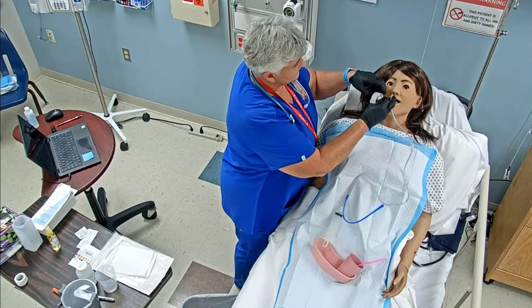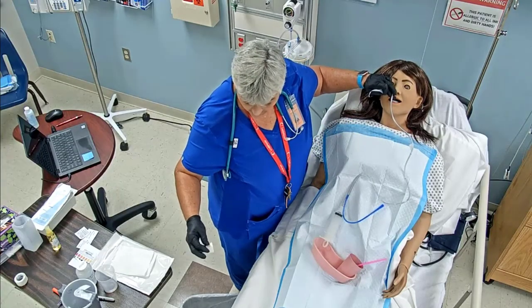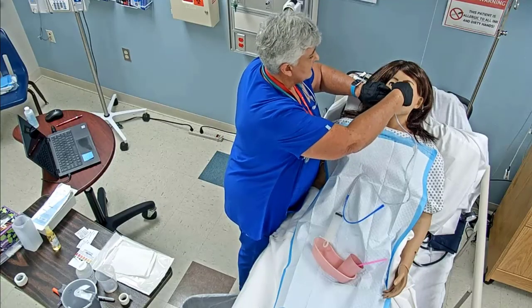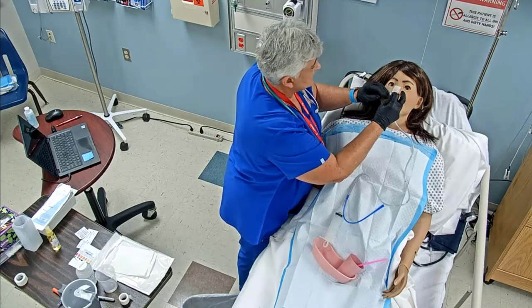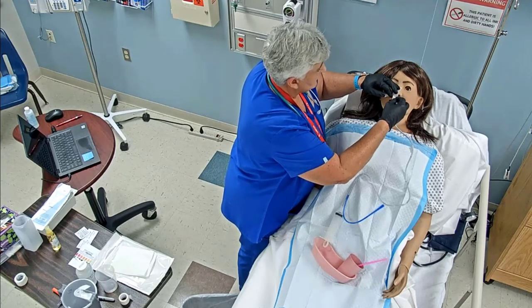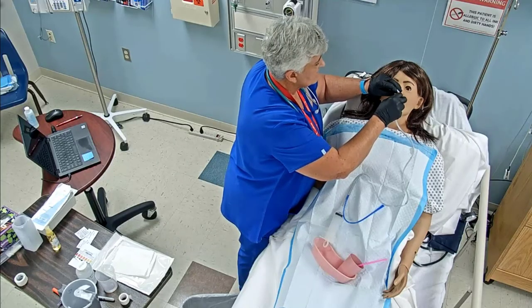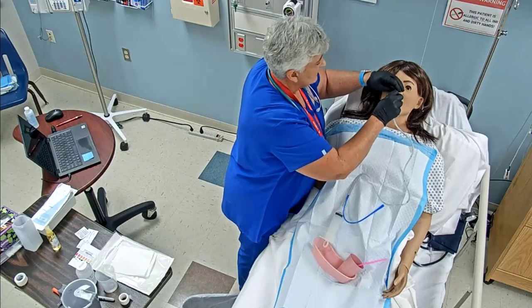Remember, this has lubricant on it, so you're going to use your securement device and put it on the nose. We assessed our nose to begin with. We're going to tear this in half, take part of that, and go around this side of the tubing so it anchors it in place. Then we're going to go around this side here.